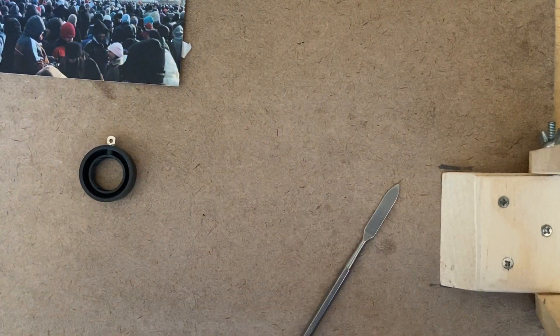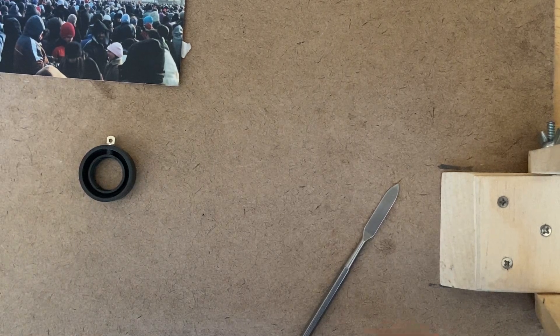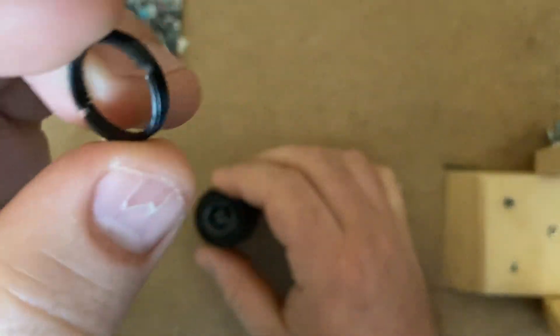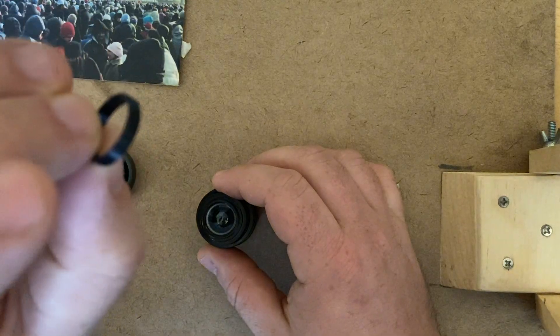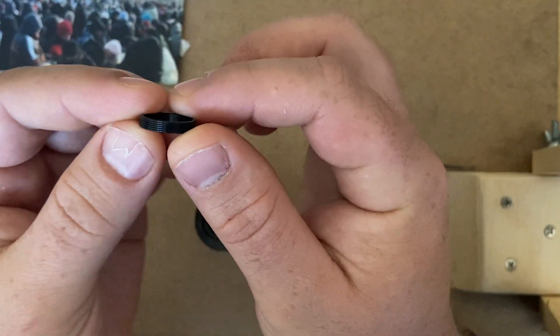I've almost got this little ring out. This ring is threaded and it holds the lens in place. I'll just hold it up to the camera — a little threaded ring. So I took that out, and now the eyepiece lens should fall out.